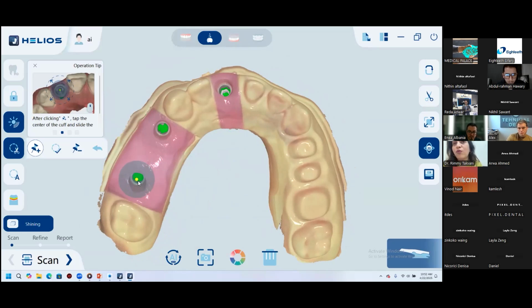Other scanners are video based scanners. There are a lot of scanners in the market. Here, what we see is the Helios 500. It's a video based scanner. So basically, when you compare with video frames per second, the number will always be small.